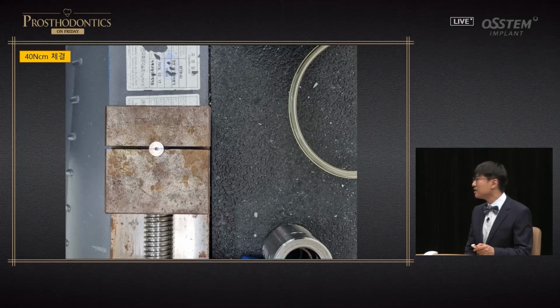It may differ, but if you use Austin's product and if you gradually increase the torque very slowly so that the change felt by us is very minimal, it could be okay. And in single restorations, because the steeper 11-degree connection is very strong, I think it can be used for single restorations as well.